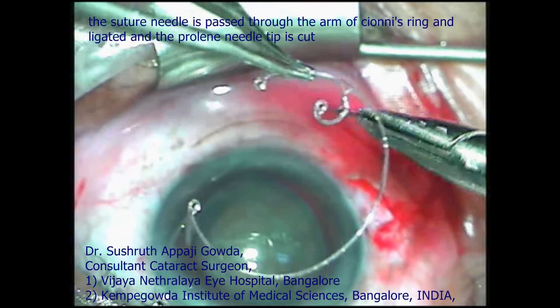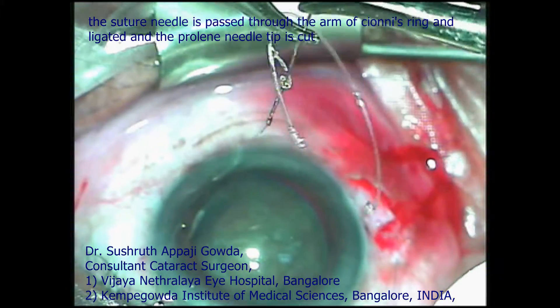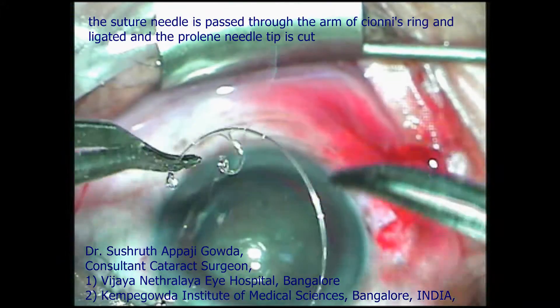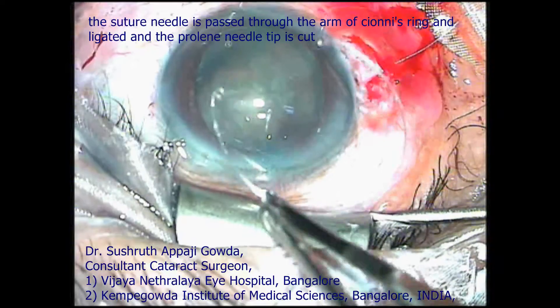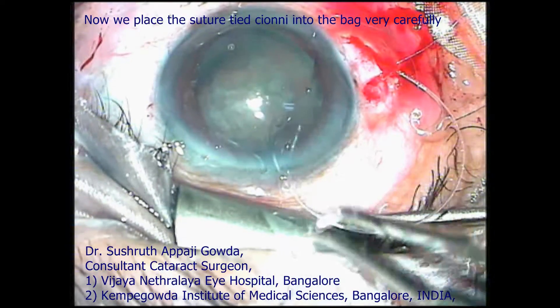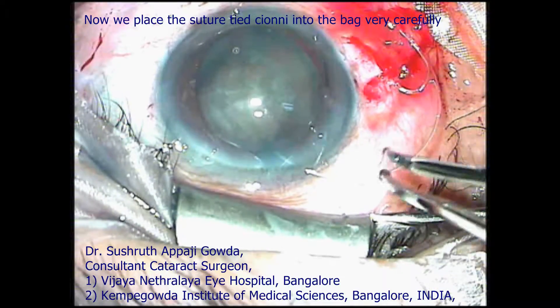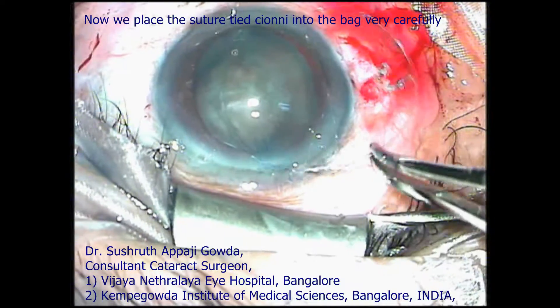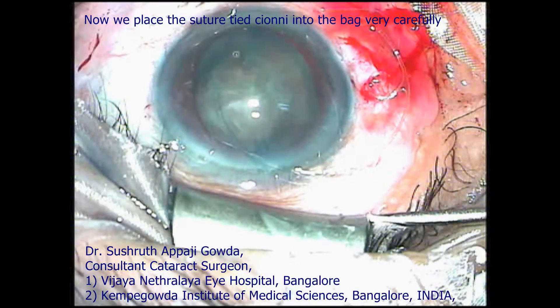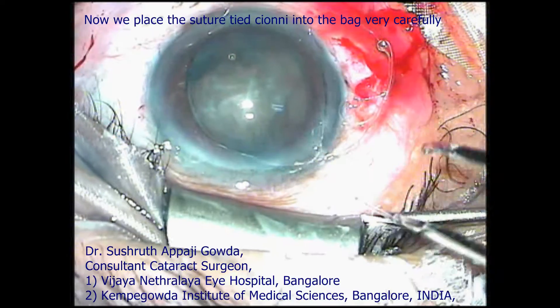This needle is passed through the Cionni ring and ligated to the arm. After tying the Cionni ring and cutting off the straight needle part of the suture, the Cionni ring is carefully tucked into the bag. We have to be very gentle during the entire procedure, taking care not to damage delicate tissues.